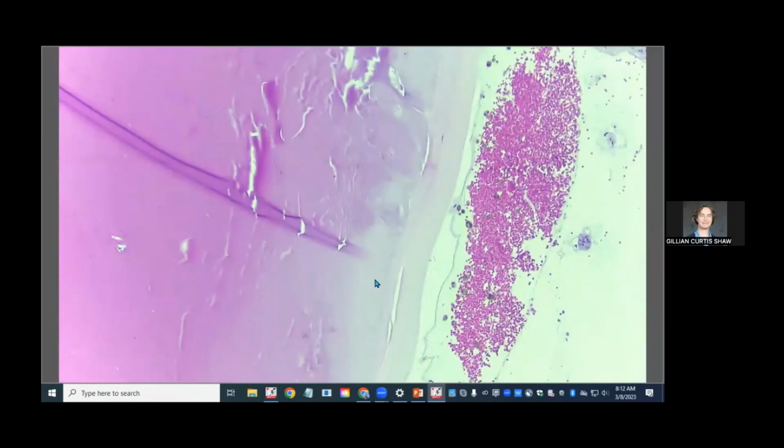And one of the features of congenitally abnormal lenses is that the posterior lens capsule is actually much thicker than it normally should be. So this is reading the book in that case. So this is probably a congenital or a juvenile cataract, at least juvenile. Okay, I think I've covered all of the main features of the slide.